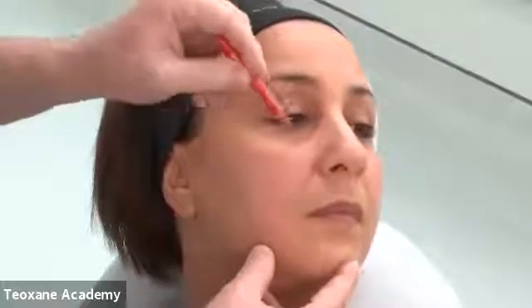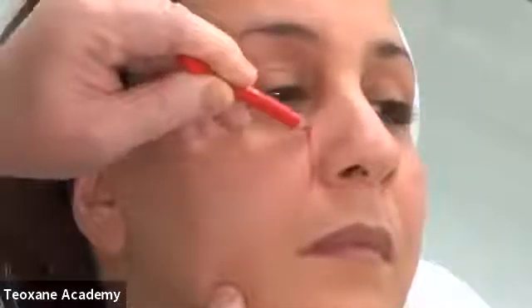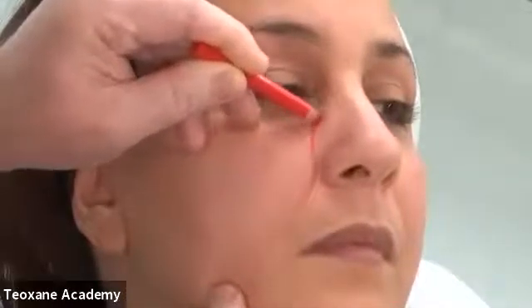So if I turn a little bit like this, and if we zoom a little bit on this area, you will see that my facial artery will be here. So it means in the nasojugal groove, and then it goes on the side of the nose. You can see sometimes the angular artery beating here. So it's far away from my tear trough.